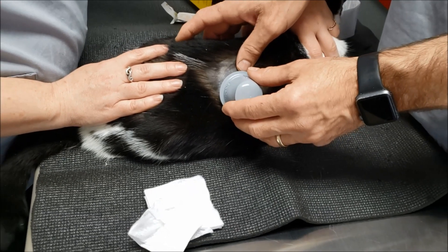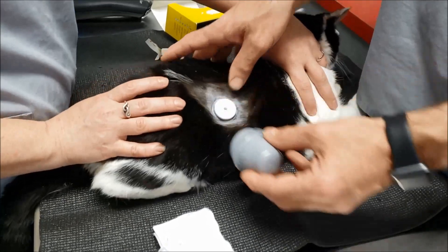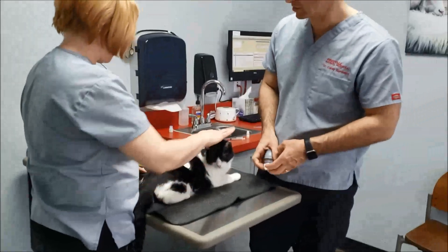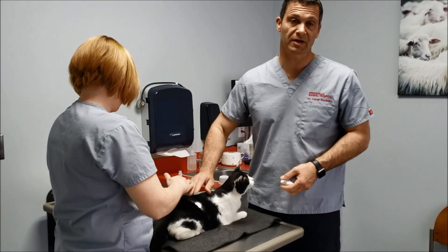Once it seems like it's adhered, we can just remove it. There she is — she's all set for the next two weeks. We'll see where the numbers get us and go from there.